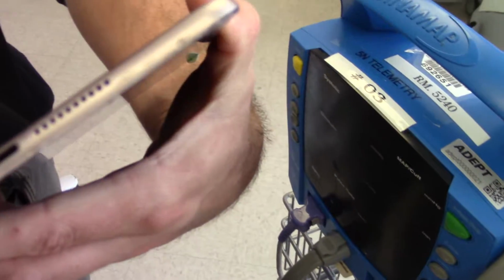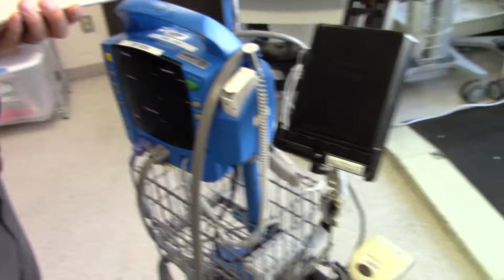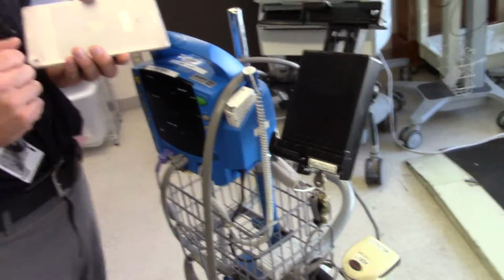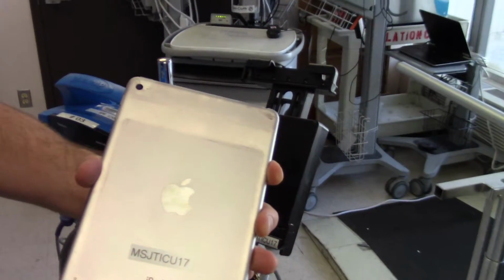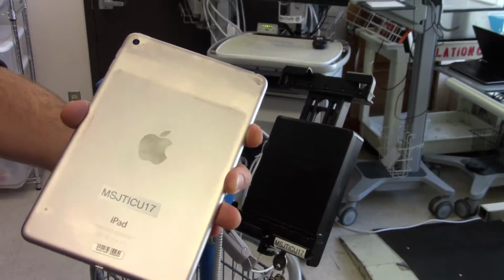Oh wow. Okay. Just from having all the liquid intrusion from the cleansers. Correct. Because they have to get it wet and it has to have a dwell time. With the ammonia wipes, I think the dwell time is 2 minutes. With the bleach wipes, I think it's 5 minutes. So you need to have it sitting wet for a period of time, and that's something infection control that our folks are trained on. You can also see the damage it does to the back of the case, where it's bleached out in certain areas. That doesn't really affect functionality.